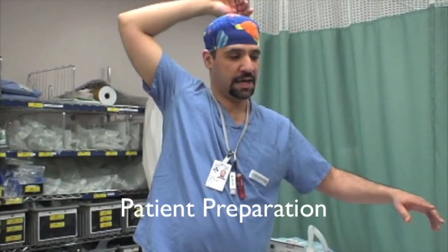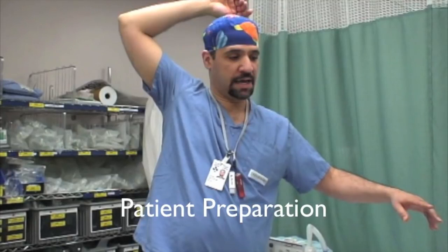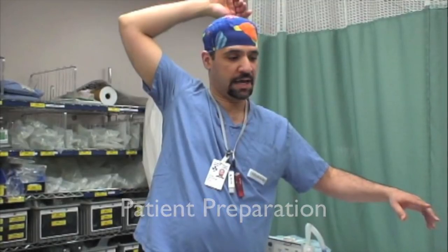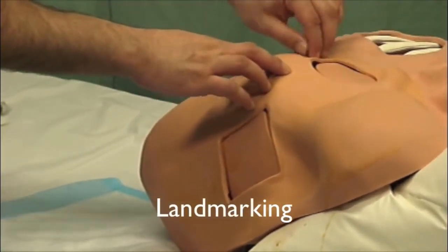Apply supplemental oxygen, pulse oximeter, cardiac monitor, and BP monitor. Consider medication for sedation and analgesia. There are two acceptable insertion sites.